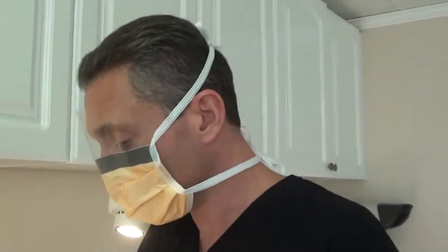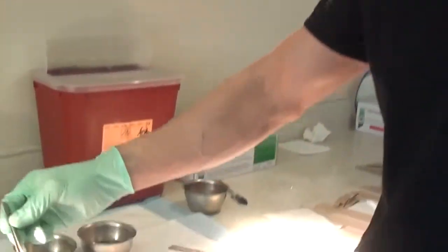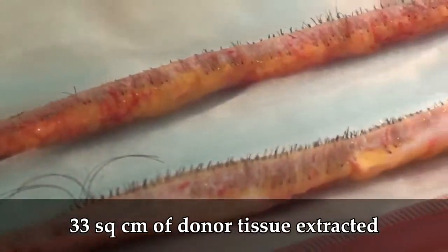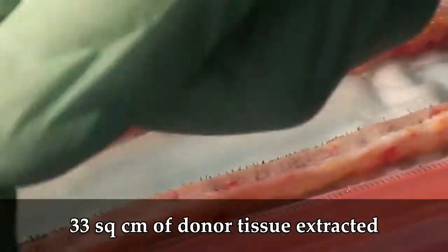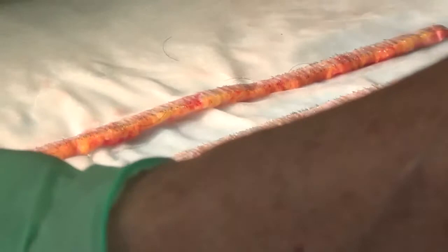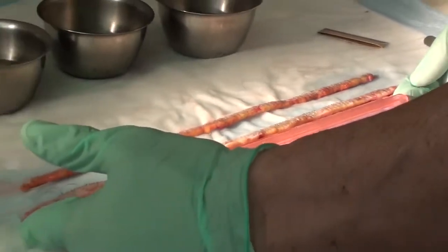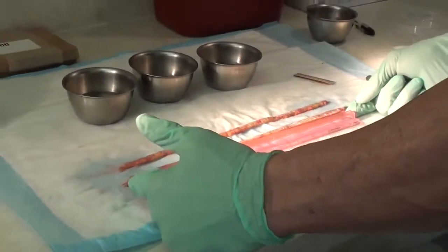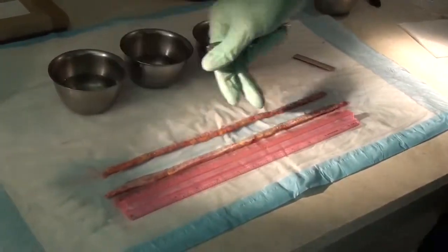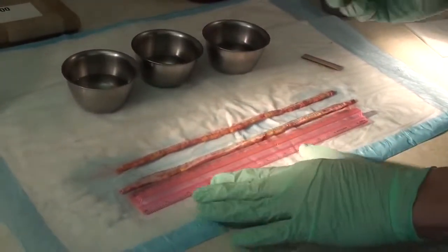Okay, so we just got through harvesting the donor, and what we did is we excised the entire old donor suture line out. We were able to pull out 33 square centimeters of tissue. As you can see here, this is a ruler, which is 12 inches, which is also approximately 30 centimeters. So there's 30 centimeters, then we have an additional about 3 centimeters on each thing. So each one's approximately 33 centimeters.